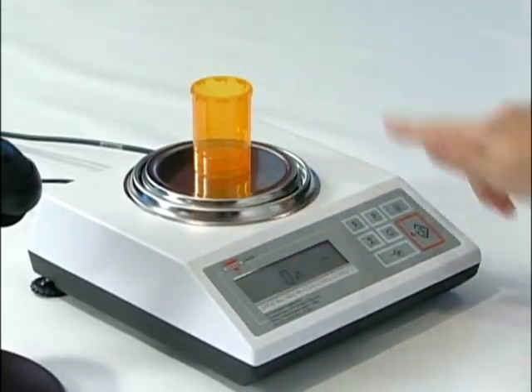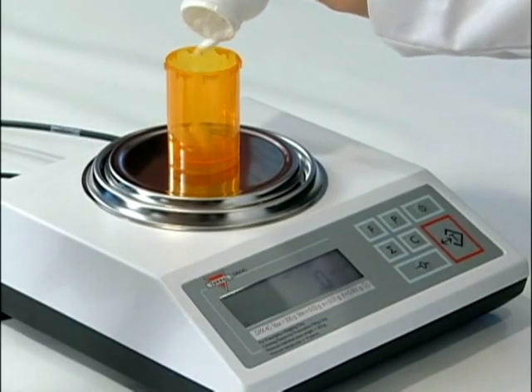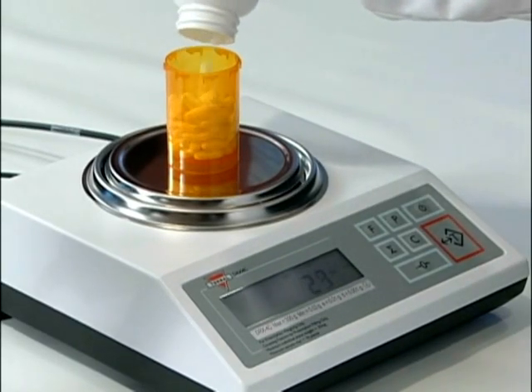Here are the steps again. Step 1: Tare the container. Step 2: Scan the supply bottle. Step 3: Pour the pills into the vial to achieve the desired count.